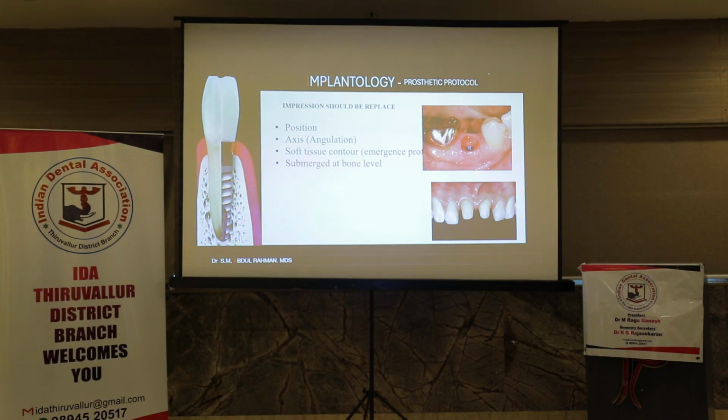Normally for FPD or tooth cutting, we are just replacing the tooth, just the morphology of the tooth. But in implant we need to look for position, angulation, and of course that implant should be submerged into the gingiva. So you need a good collar, emergence profile. So all should come into the cast.